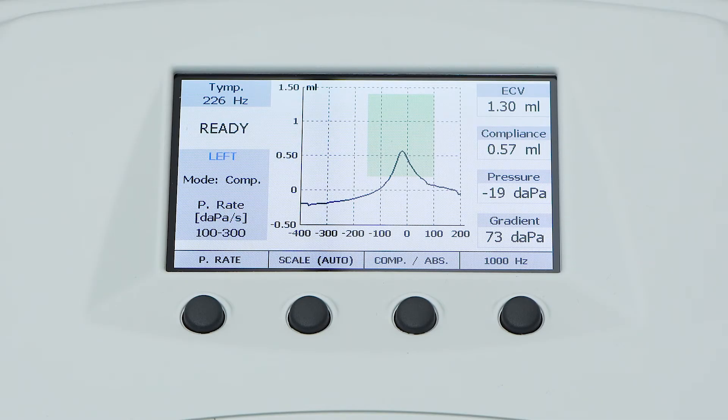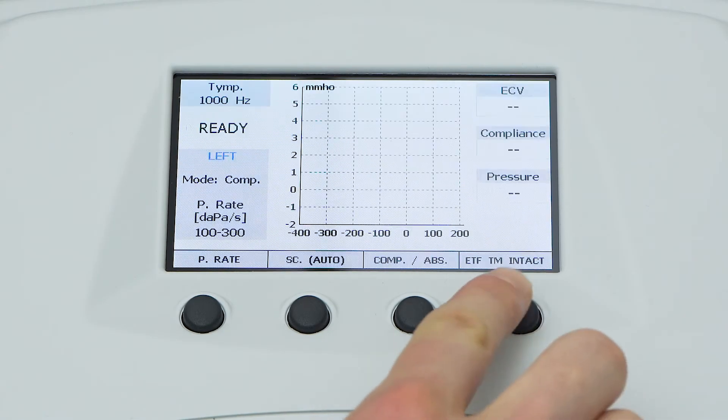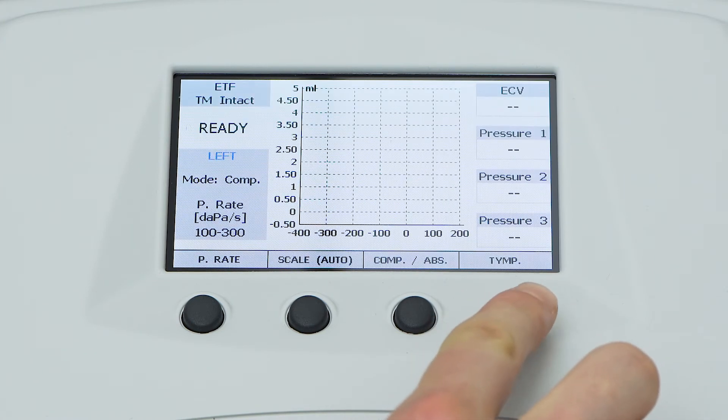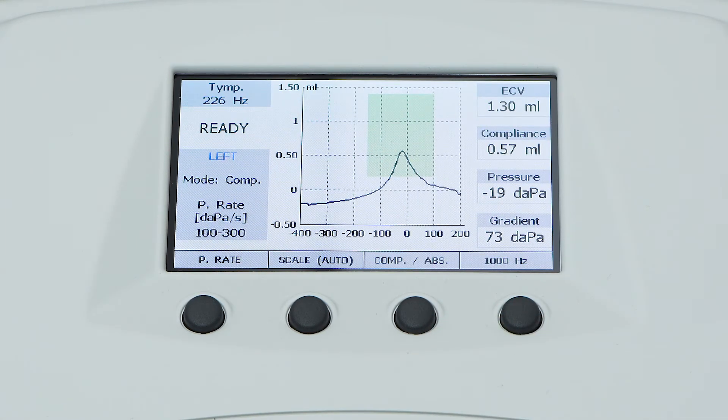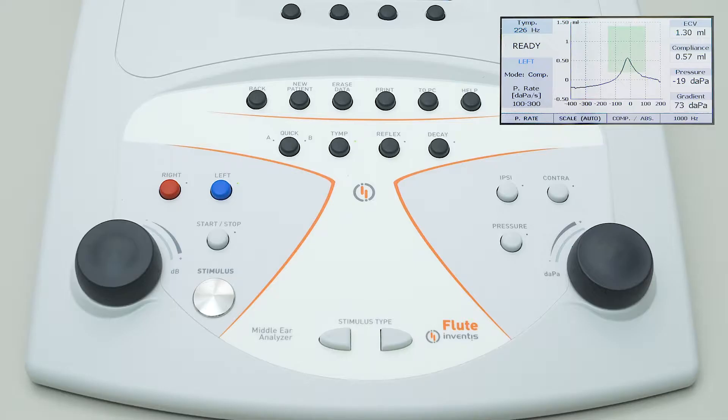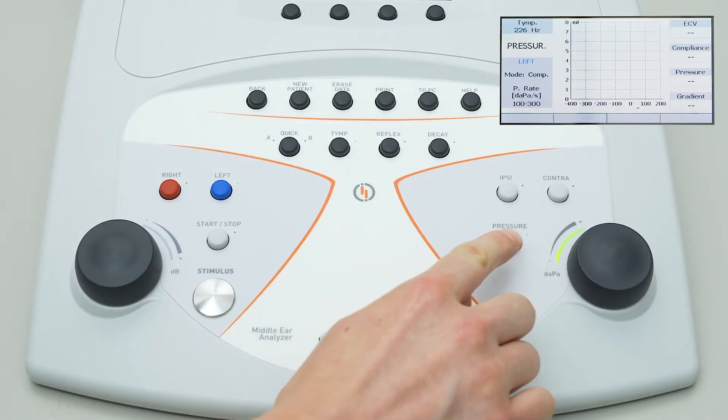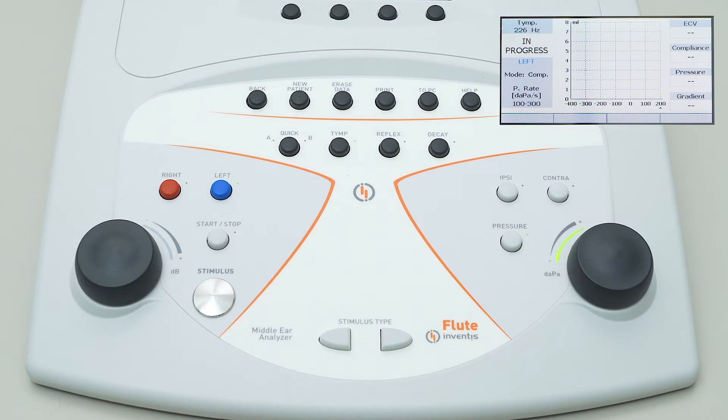On Flute HF and PLAS models, the frequency of the probe tone can be changed from 226 to 1000 Hz by simply pressing the corresponding function button next to the display. Only on Flute PLAS models is it possible to conduct the test in manual mode — simply press the pressure button to prime the system and start the test.